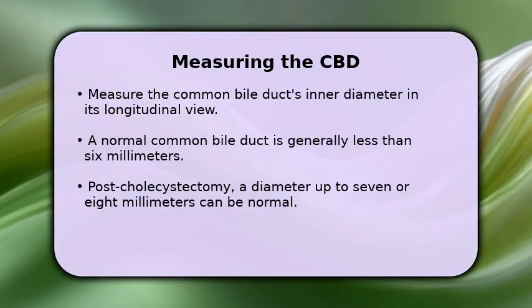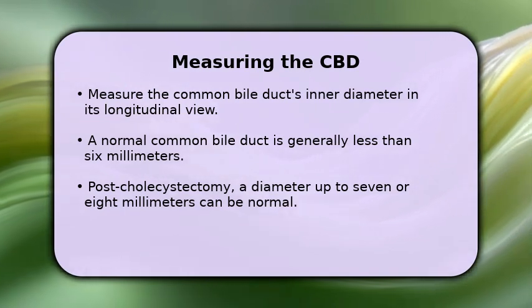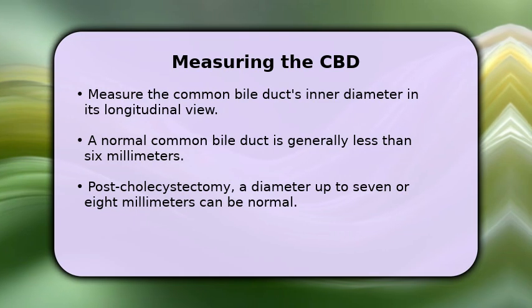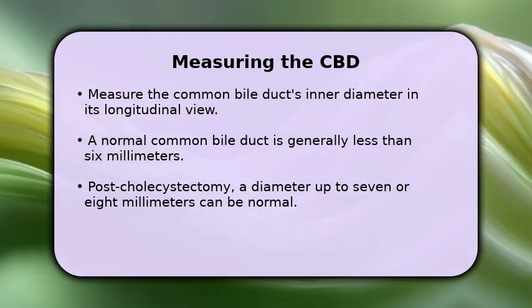Once you have a clear longitudinal view, measure the common bile duct from inner wall to inner wall. A normal common bile duct typically measures less than 6 millimeters in diameter.